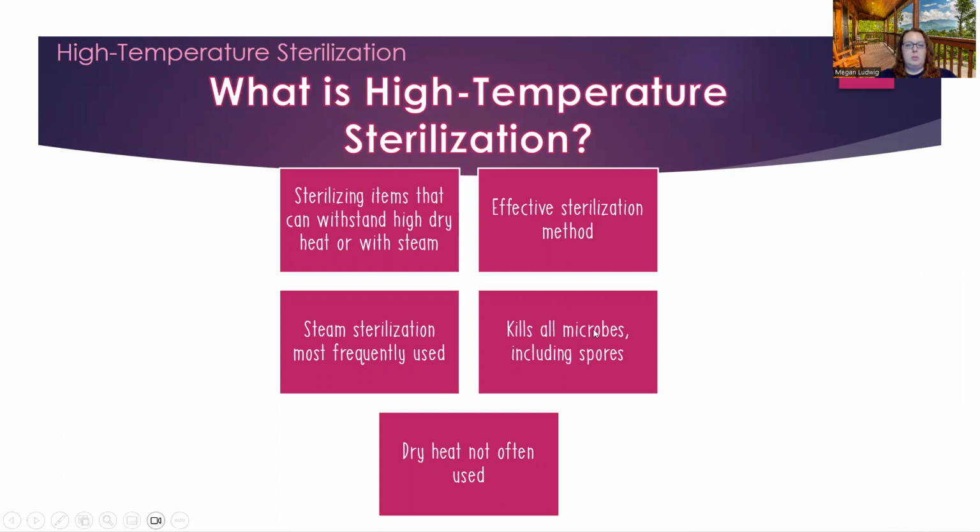So sterilizers kill all microbes, including spores. That's the whole purpose of sterilization, to kill microbes, including spores, because the spores are the hardest to kill. So in these high temperature sterilizers, typically you're going to use steam type heat and not dry heat.